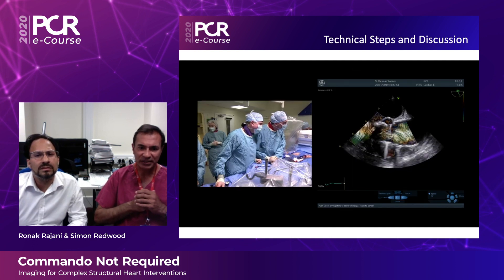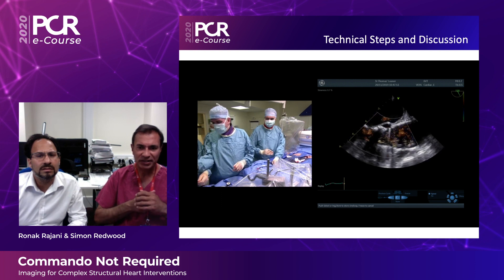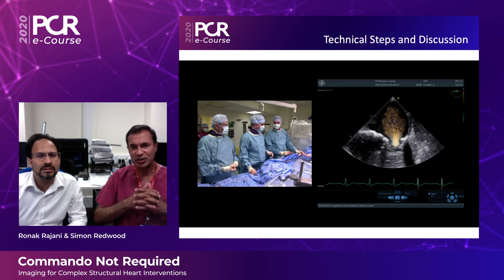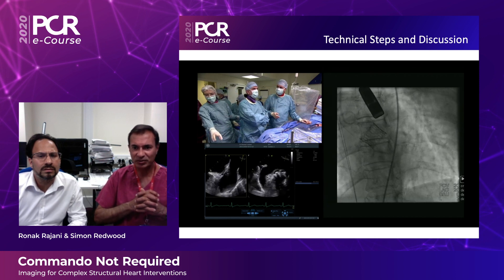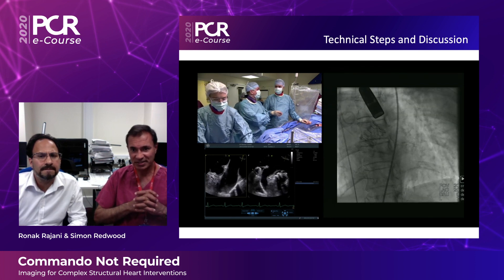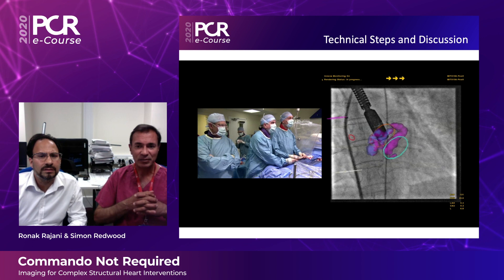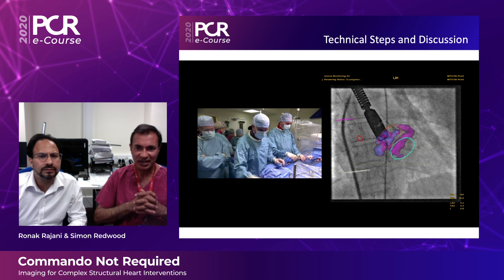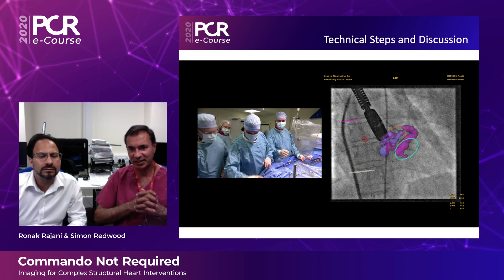Here you can see blood speckle imaging on the right-hand side, and shortly you'll see us on fluoroscopy moving on to treat the mitral valve. You can probably see there the intense calcification — this really was a porcelain aorta — and you can also see the MAC quite clearly on the right-hand side. Here you see the image fusion with CT, which helped guide the position of the transeptal puncture. You can also see the orange and light blue circles indicating the optimal positioning of the 29mm Sapien III.